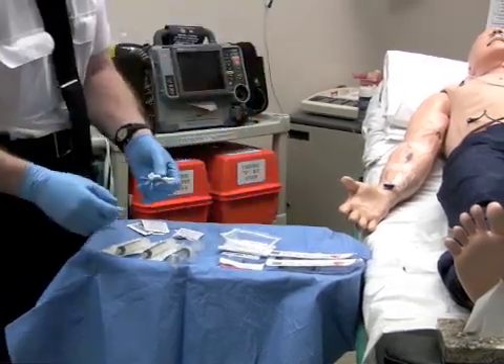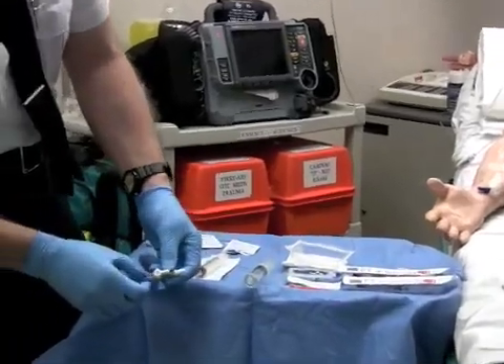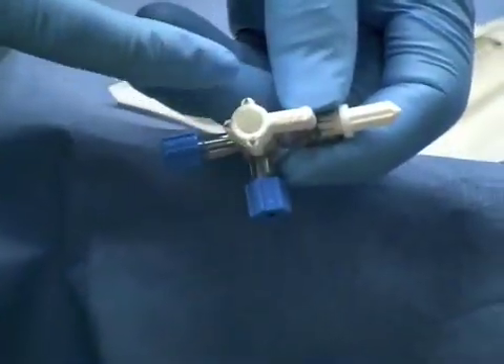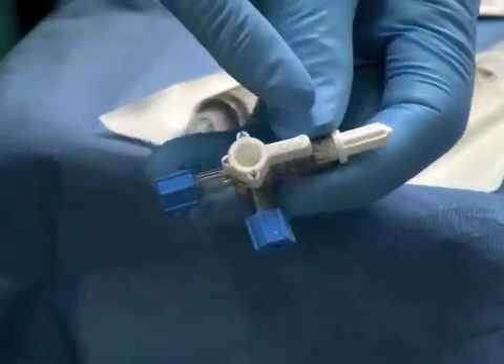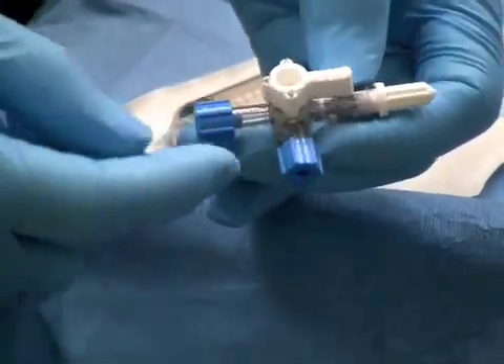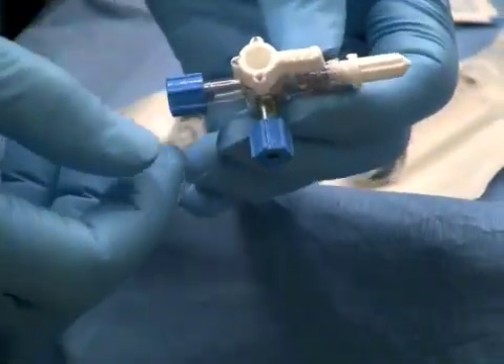And now the use of the three-way stopcock. This is essentially three little channels — you are going to have to look closely because you really can't see that very easily. This is neutral, so no flow in this direction and flow to any of the presenting inlets or outlets.